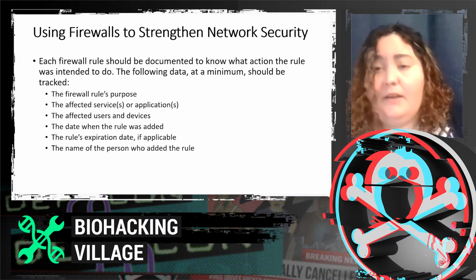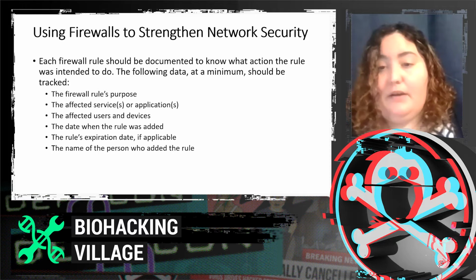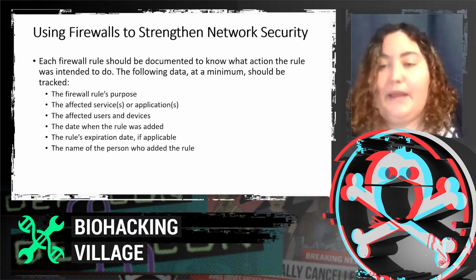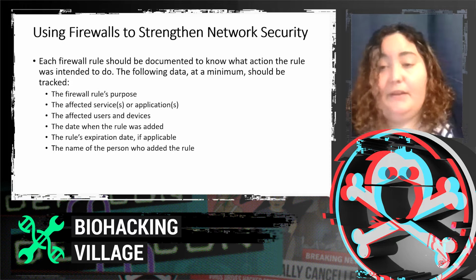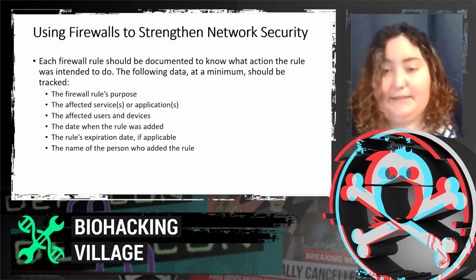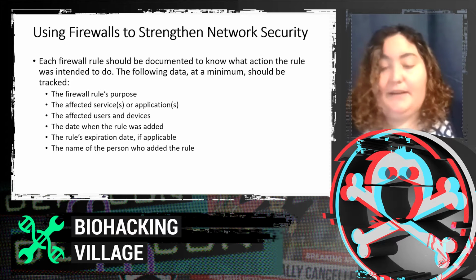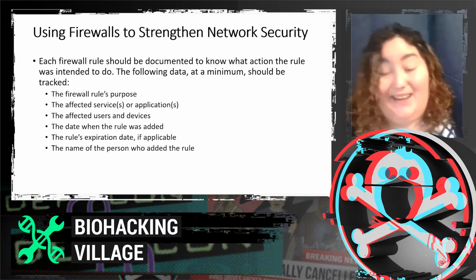The approach of quality control over traffic can be achieved by controlling the last rule in an access control list to deny all traffic. This can be done explicitly or implicitly depending on the platform.